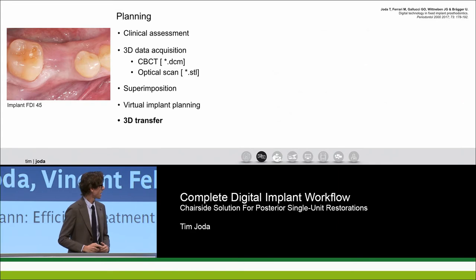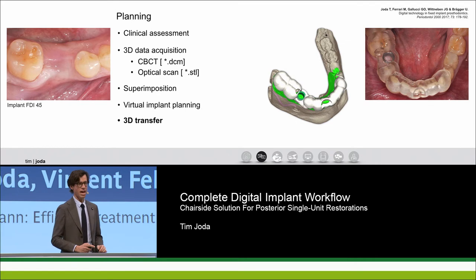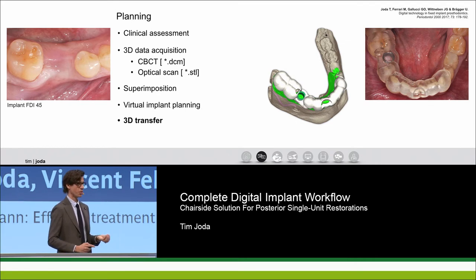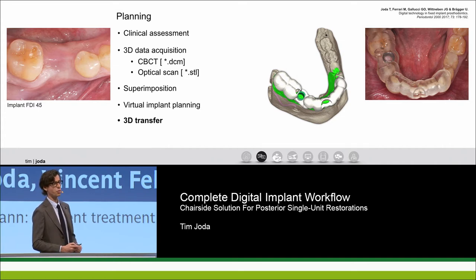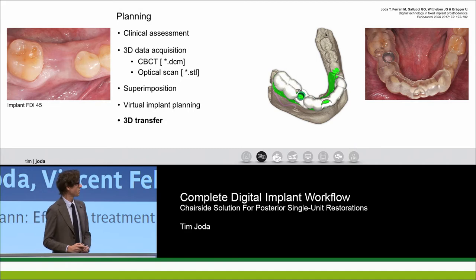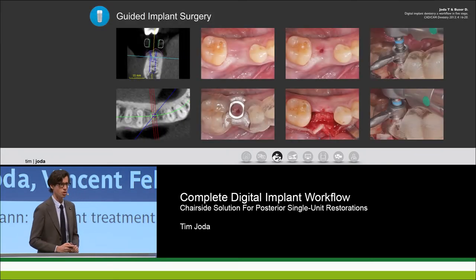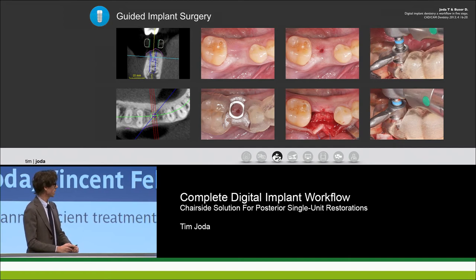Based on the STL file, you see the guide design on the left, and that is why these guides have such a nice clinical fit. Here is the printed guide with the sleeve inside for a fully guided implant placement approach. These are the surgical steps in collaboration with our partners from the Department of Oral Surgery.